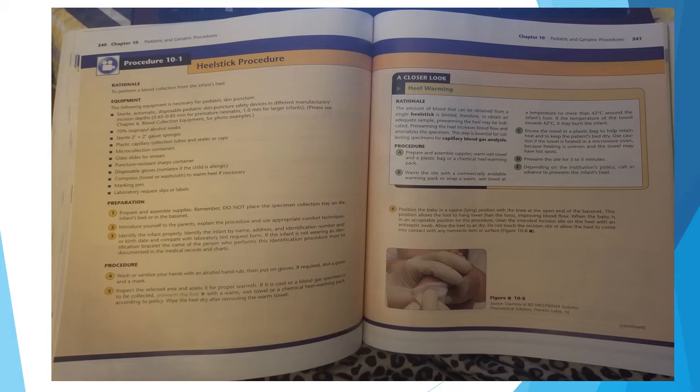Equipment: the following equipment is necessary for pediatric skin puncture: sterile, automatic, disposable pediatric skin puncture safety devices from different manufacturers, with incision depths of 0.65 to 0.85 millimeter for premature infants and neonates, and 1 millimeter for large infants.